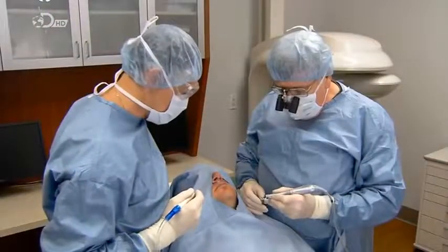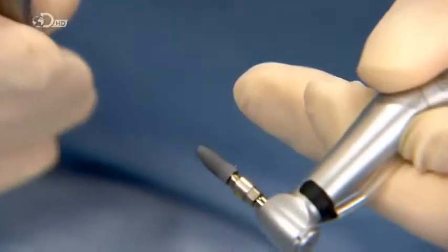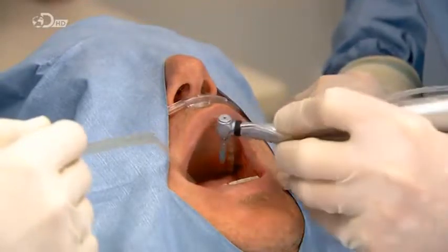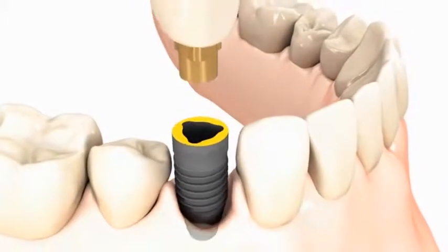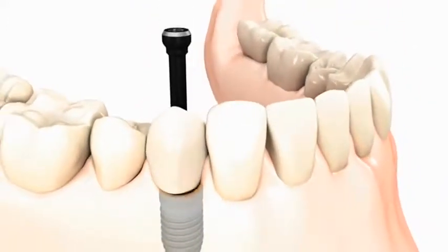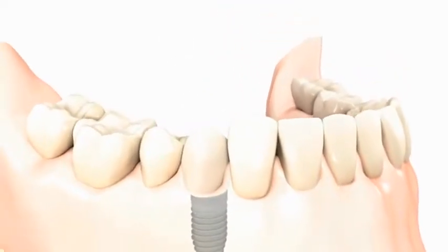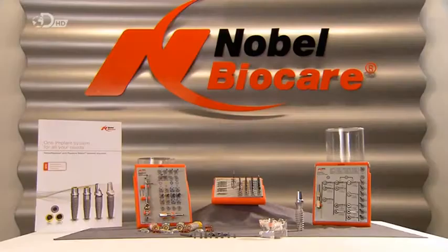After sterilization, these titanium dental implants are ready to take root in human jaws. The clinician screws the implant into the patient's jawbone and then secures a made-to-match ceramic tooth to it. Over time, bone will fuse with this artificial tooth, providing a long-lasting tooth replacement and giving the patient every reason to smile. Open wide.